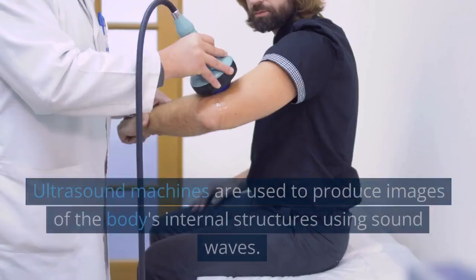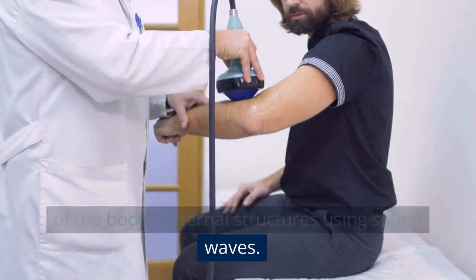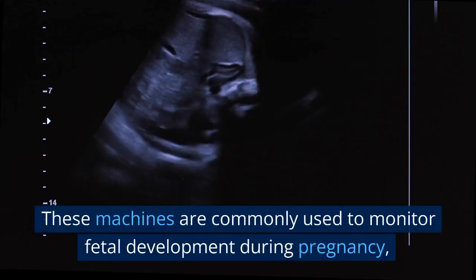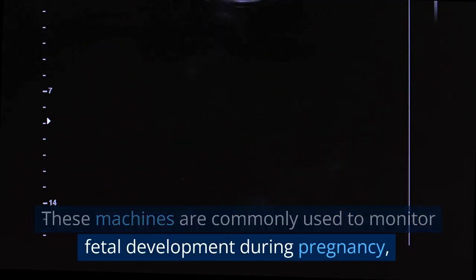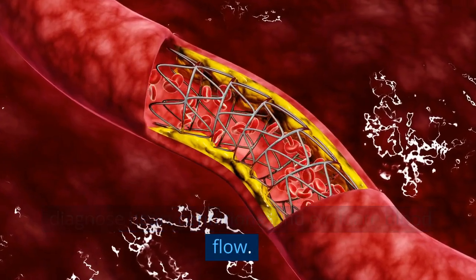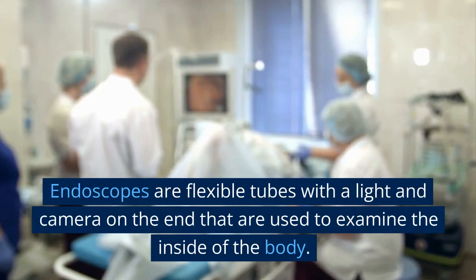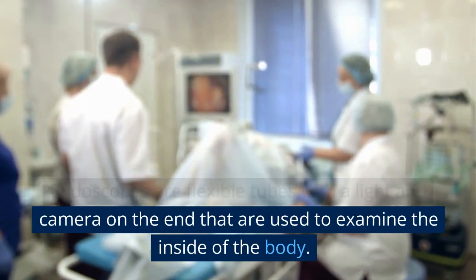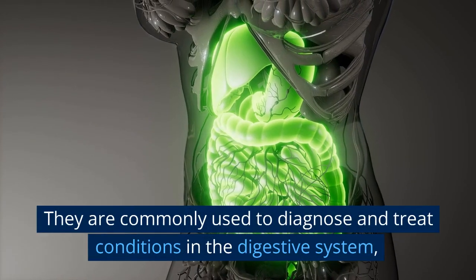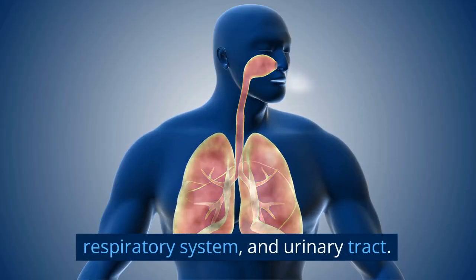Ultrasound machines are used to produce images of the body's internal structures using sound waves. These machines are commonly used to monitor fetal development during pregnancy, diagnose heart conditions, and evaluate blood flow. Endoscopes are flexible tubes with a light and camera on the end that are used to examine the inside of the body. They are commonly used to diagnose and treat conditions in the digestive system, respiratory system, and urinary tract.